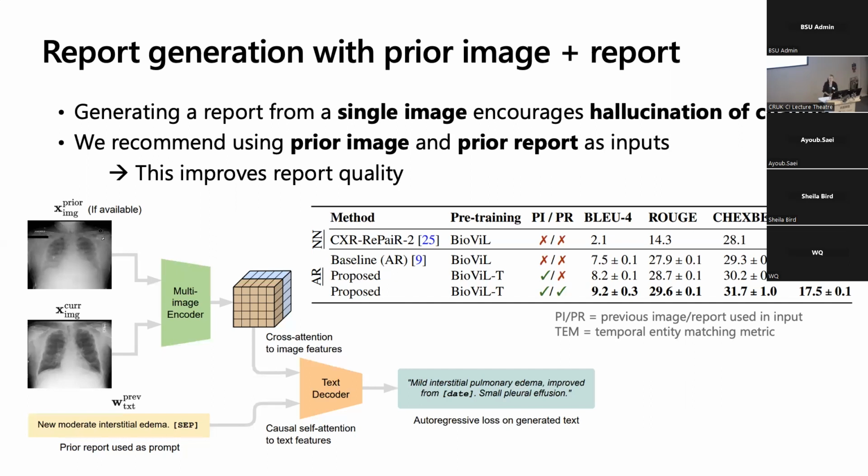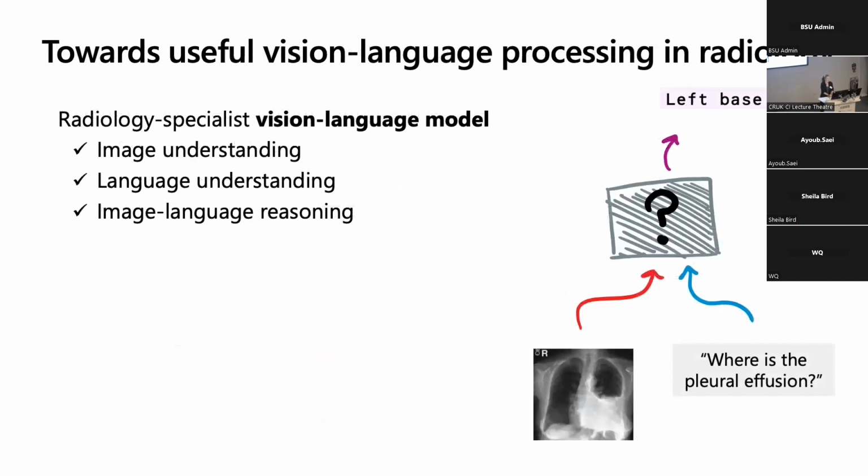Basically what you do is you look at how the change words in the ground truth report correspond to the change words in the generated report. So evaluation of text generation is really quite complex, so that's why we have so many different metrics. But the idea here is that we're trying to check, is our model generating the word "improving" when it should be, or perhaps not? So that's basically it for the results.